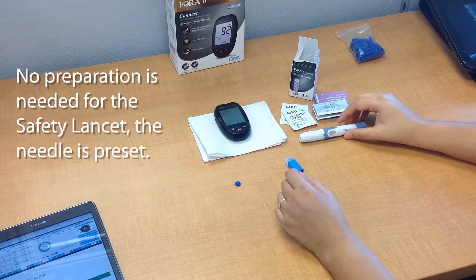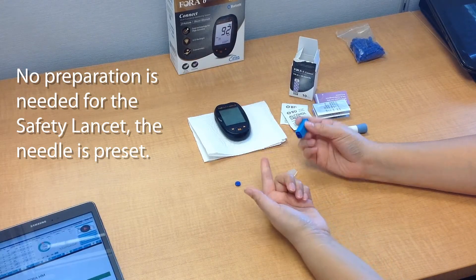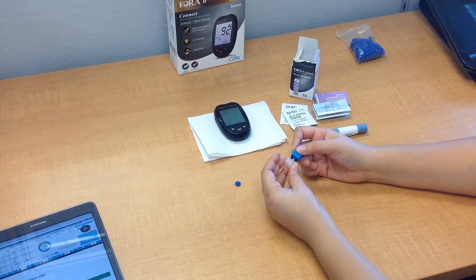Now, if you're using a safety lancet, no preparation is needed. You just have to remove the cap — the needle is already preset — and then you do your test.